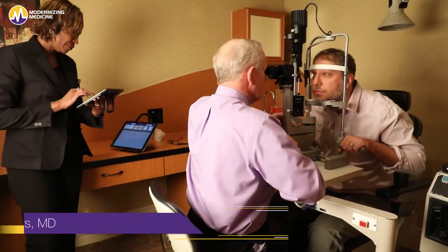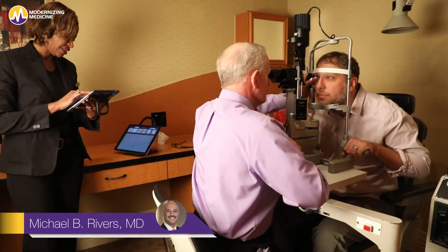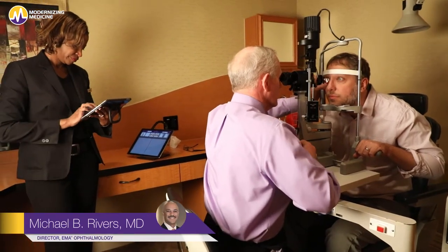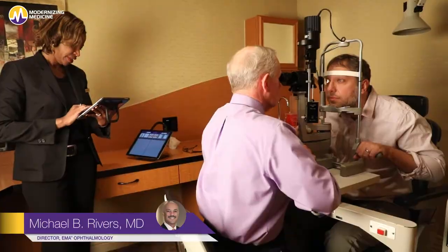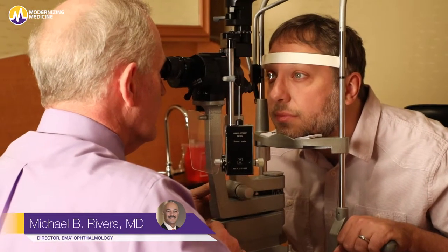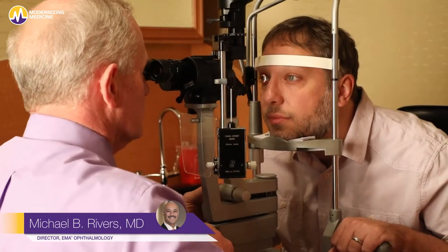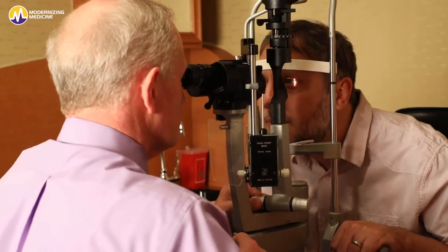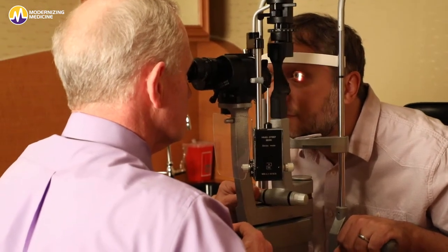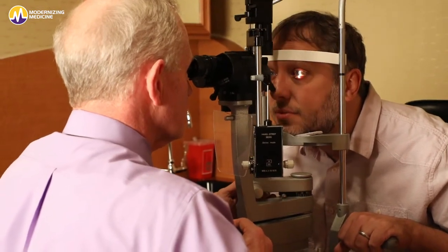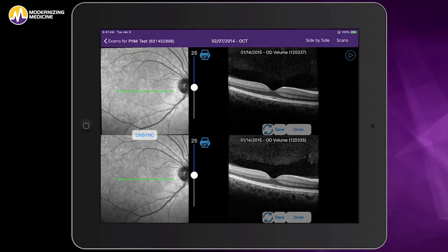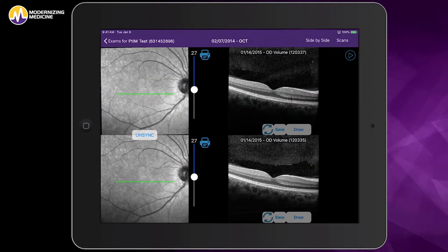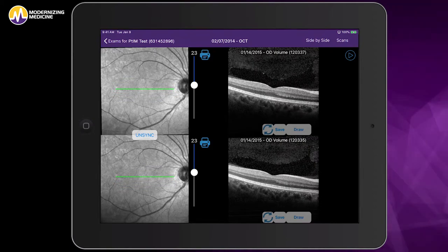Hi, my name is Dr. Michael Rivers, Director of EMMA Ophthalmology with Modernizing Medicine, and I'd like to introduce our new image management system by giving you a short demonstration. Today, I'll be showing you just how easy it is to open and review images while documenting the findings for a patient with macular degeneration using EMMA, our ophthalmology-specific EHR.